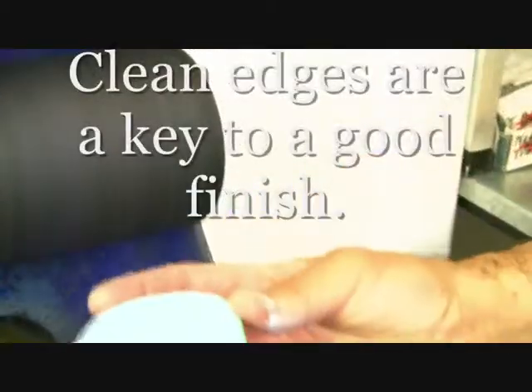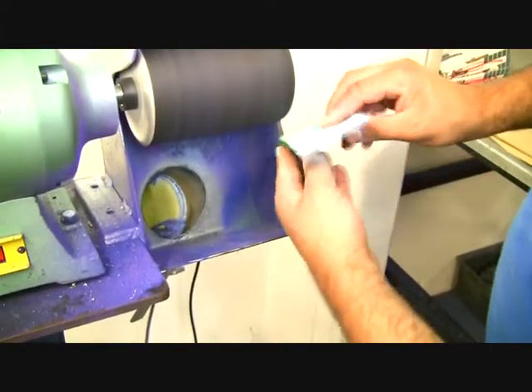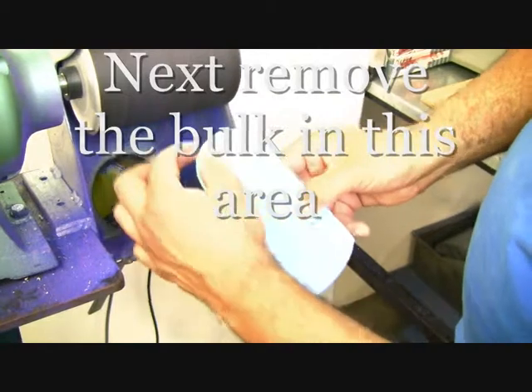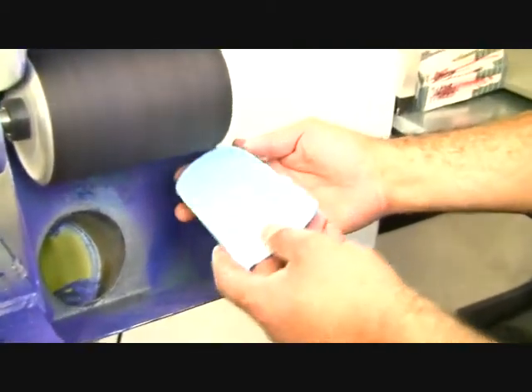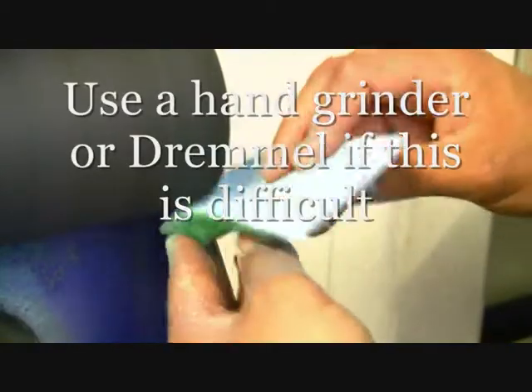Achieving clean edges at this point is important, not only for the look but also for the comfort of the patient. We need to take the bulk out of the edges so that when we apply the cover, we won't be able to see the PPT on the edges. The bench grinder can be used to do this. However, if you find this difficult, you can use a Dremel to do the same job.